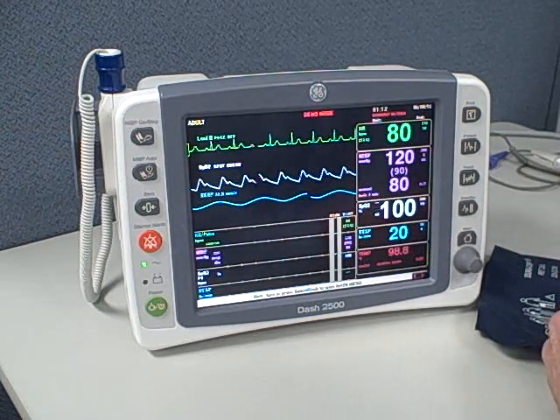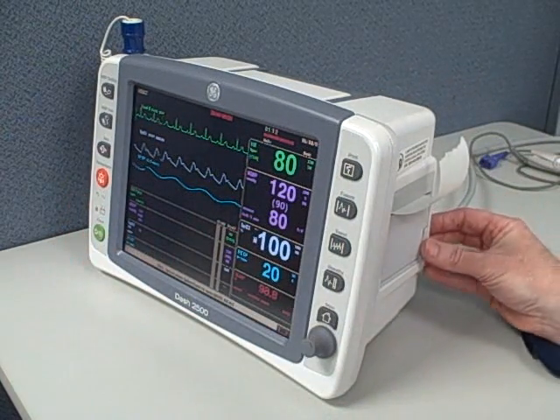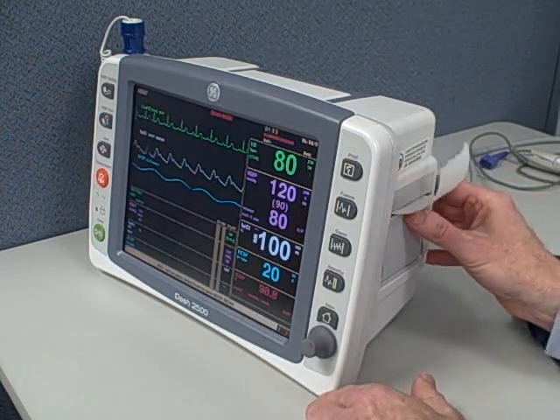Now let's take a look at the side of the machine. Here's where the self-contained printer is, if you have the printer option on your machine. It uses a roll of paper — pretty standard — and prints right out for you.